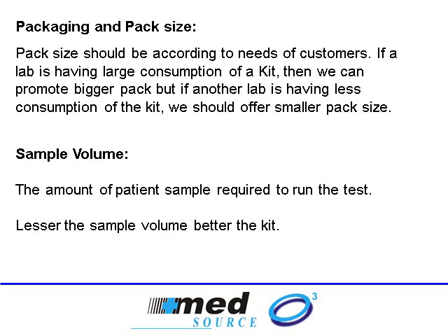Another important aspect is the sample volume, because sometimes we are dealing with pediatric samples which require a very little amount of blood or serum or plasma. So the lower the sample volume, the better the performance, or the better the characteristic of a kit.